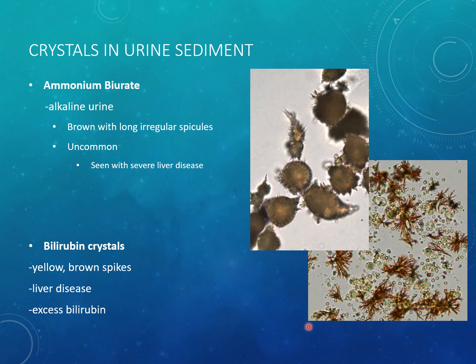They can be seen in other dogs or cats. Ammonium crystals suggest liver dysfunction or portosystemic shunting. So if it's not related to the pH, for example, it's probably something more severe like liver disease.